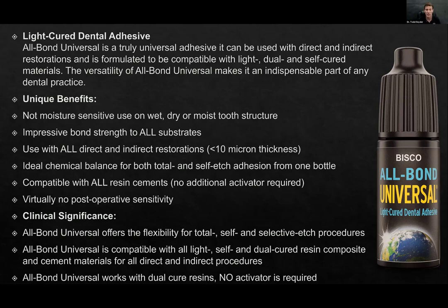I see some dentists doing my hands-on programs where they just put a little bit on trying to save some money. You know, there's a time and place to save money. This is not one of them. You don't want to have a failure or a problem and have to do this whole thing over and eat all the cost. So again, put a little extra on, make sure it gets into the tooth to completion.